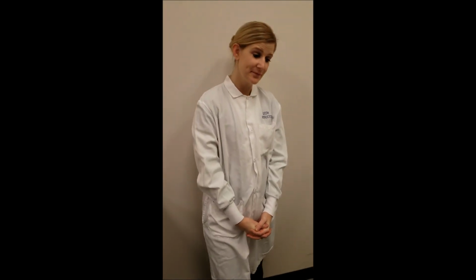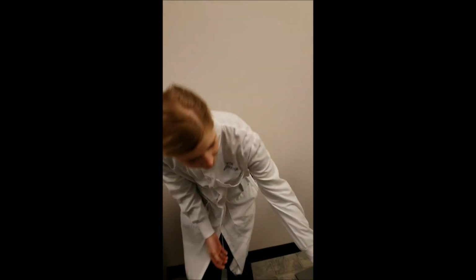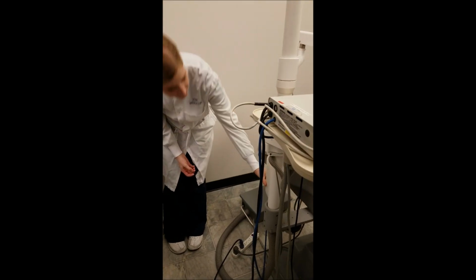This is the pre-appointment infection control process evaluation. During this, we are going to demonstrate everything that we would like you to. However, there will be parts where we give you helpful hints. You are not required to verbalize those. Those are just to help you through this process. Okay? Okay, so first she's going to check the water bottle fluid level and refill it if necessary.